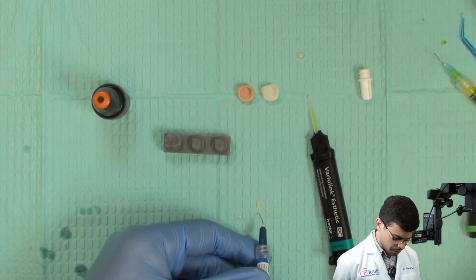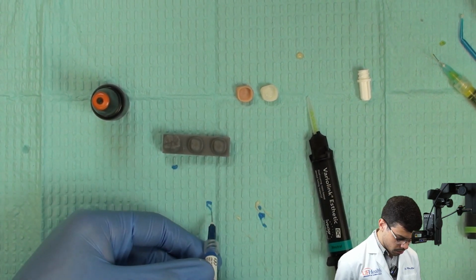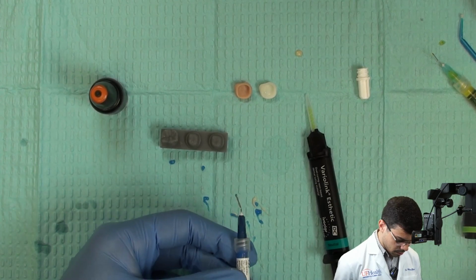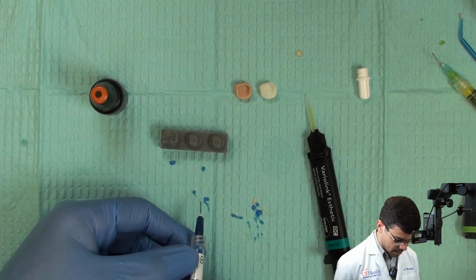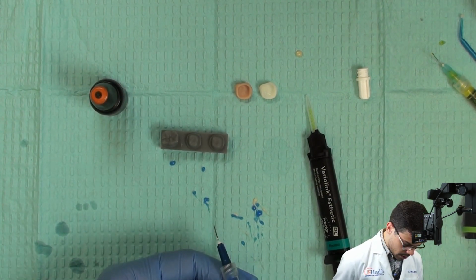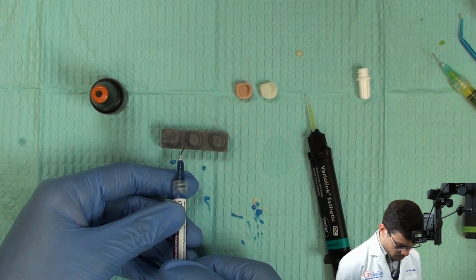So I'll just dispense a little bit here. There we go. Yeah, this acid is a little bit warm, so it's spreading all over. Sorry for it. Just pay attention that sometimes the acids, they are new, so they come pretty strong. So I'm going to do enamel selective etching.